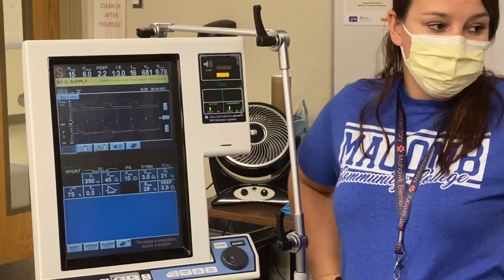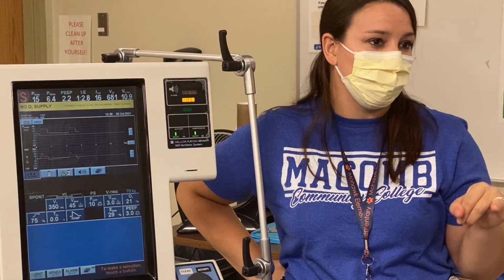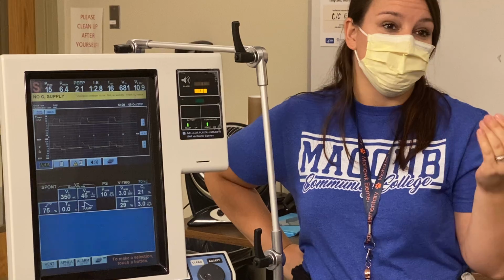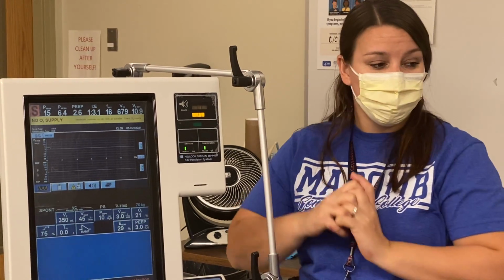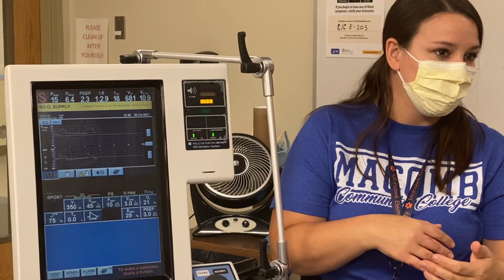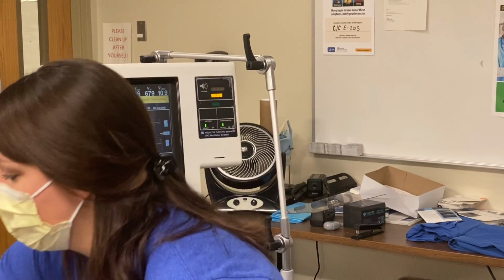So now a couple things. What I recommend doing is setting your e-sense and setting your rise time before you set your alarms, because based on what you have going, that's going to change. I'm going to put myself on the ventilator so you guys can see a very accurate e-sense and rise time and when you want to change it. I always adjust rise time first.